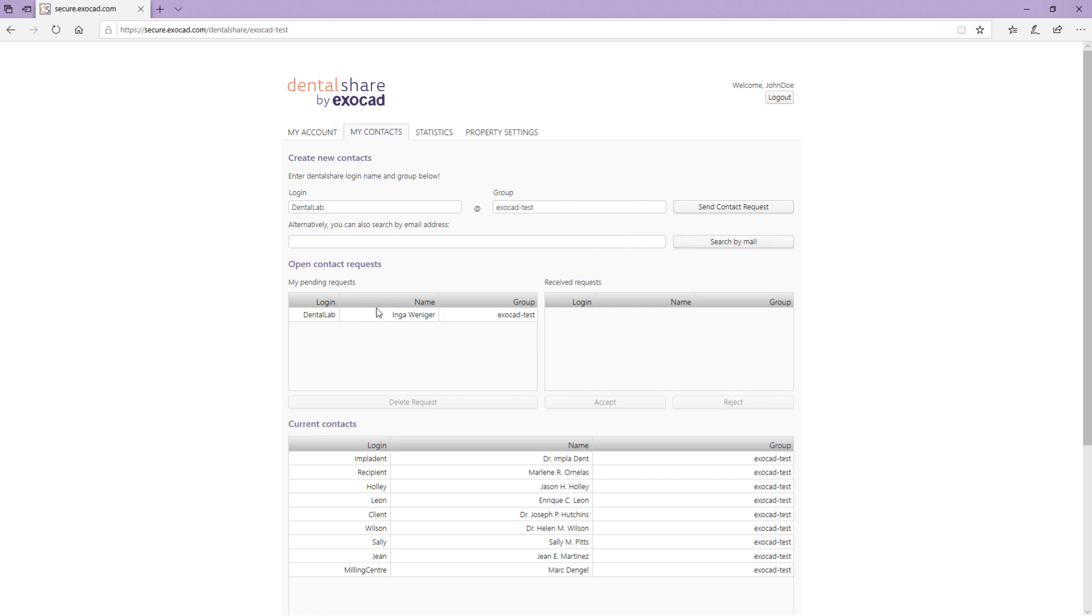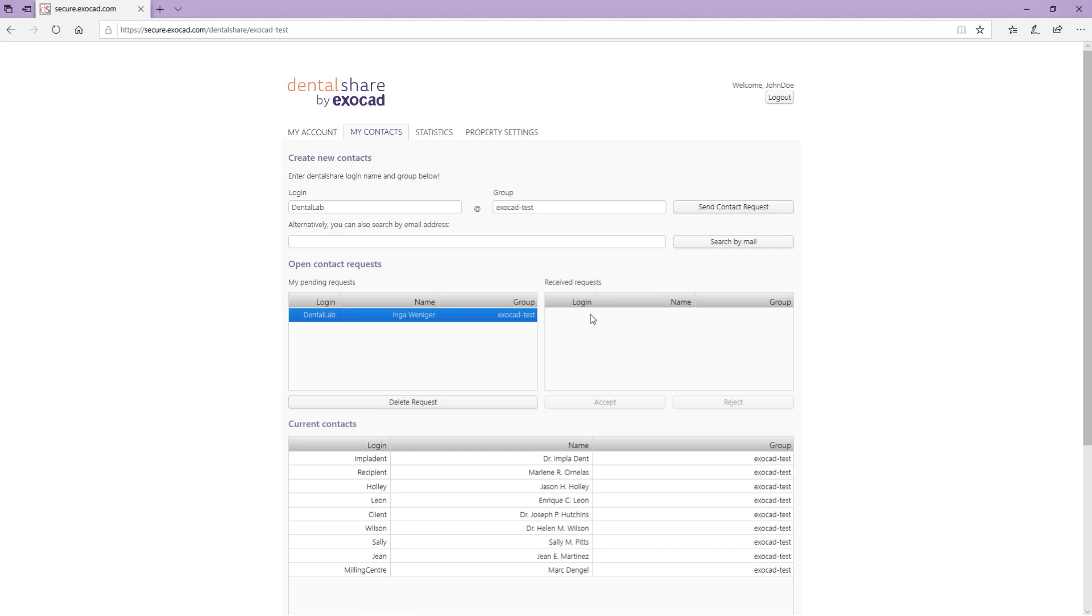Once you have sent a contact request, it appears in the list My Pending Requests. To delete a pending request, select it in the list and click Delete Request. Your received contact requests appear in the list Received Requests. You can accept or reject a request.